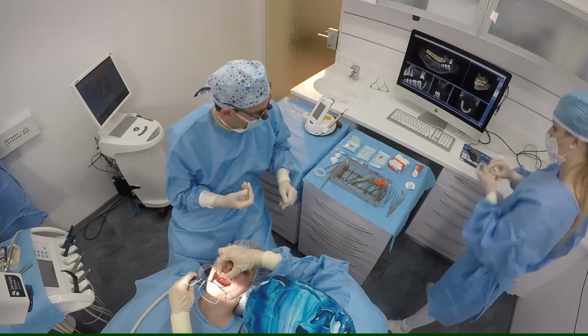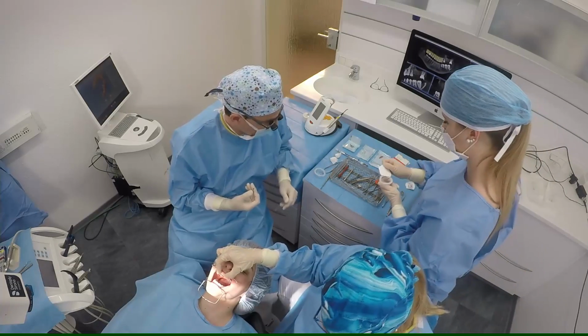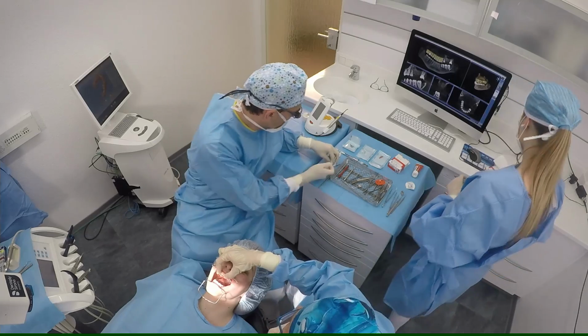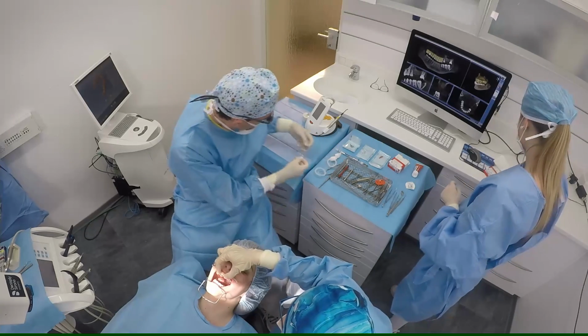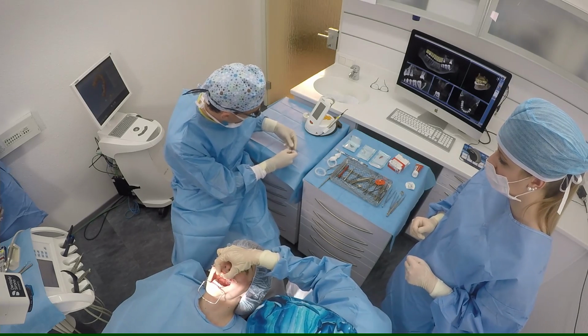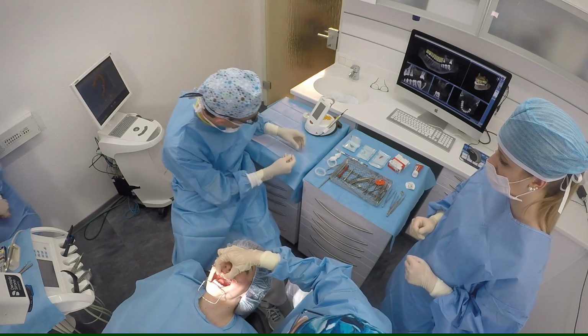And you see how the assistant is preparing the next blister. She is opening the blister, and Dr. Werling can take the implant out of the shuttle.